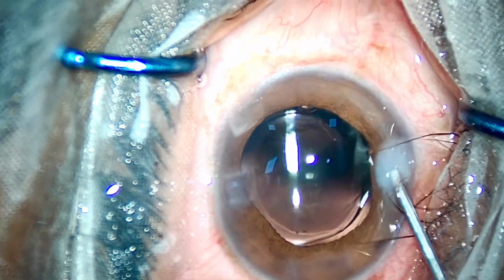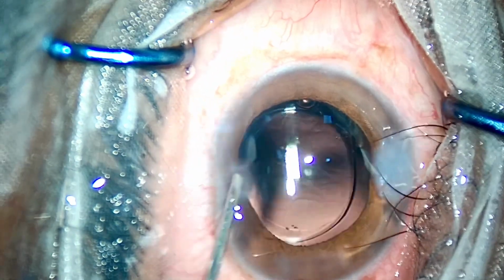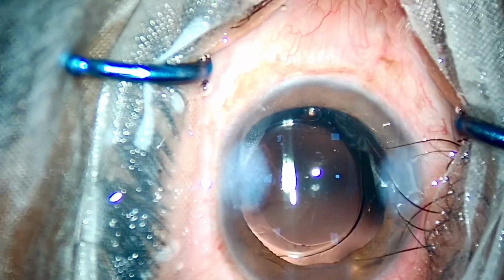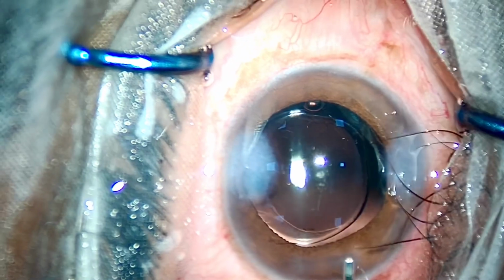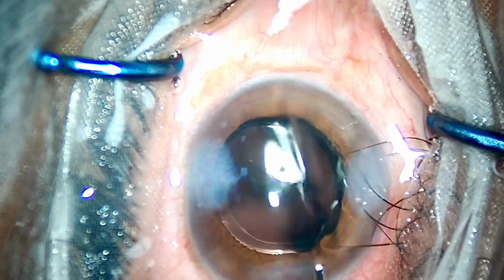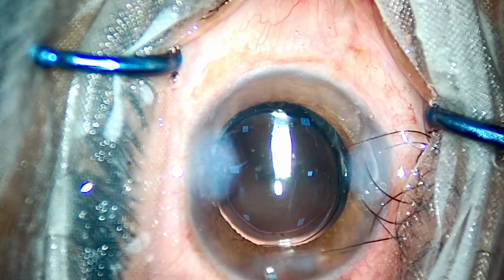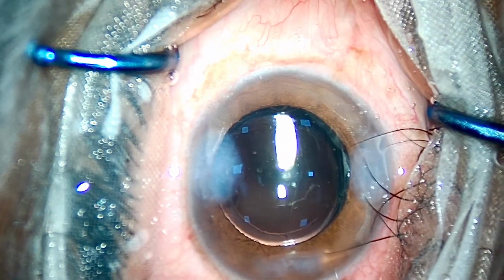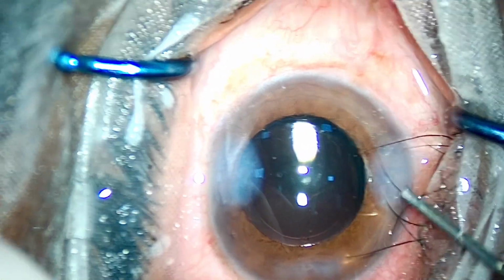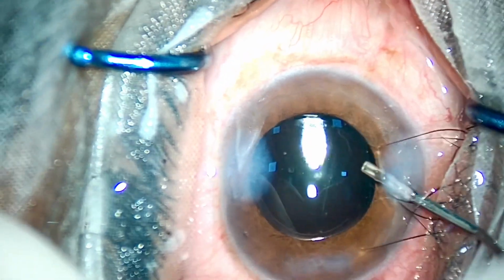This was a simple case through which I wanted to demonstrate to you the importance of astigmatically neutral incisions. Once again, just remember to put the side ports and the main port in the orientation of a perfect T. A perfect perpendicular diagram should be there.